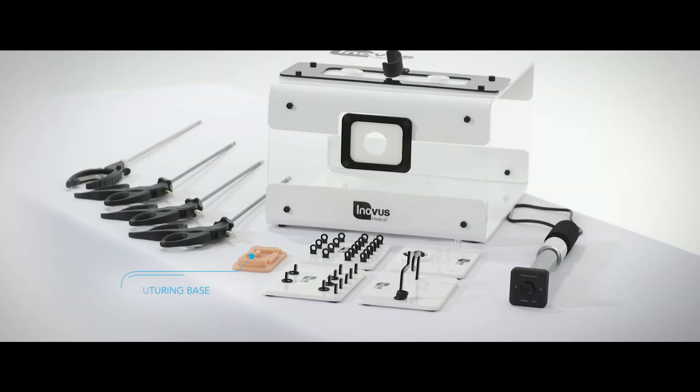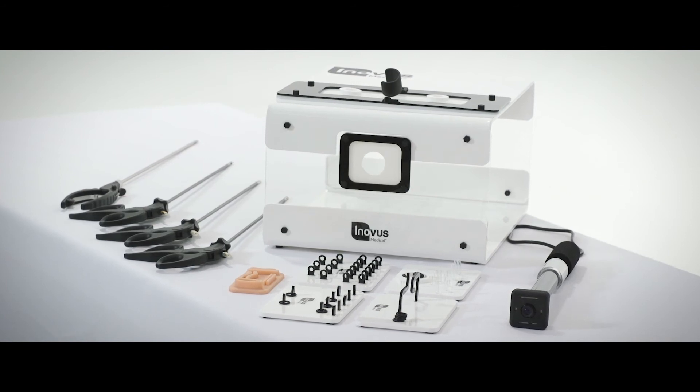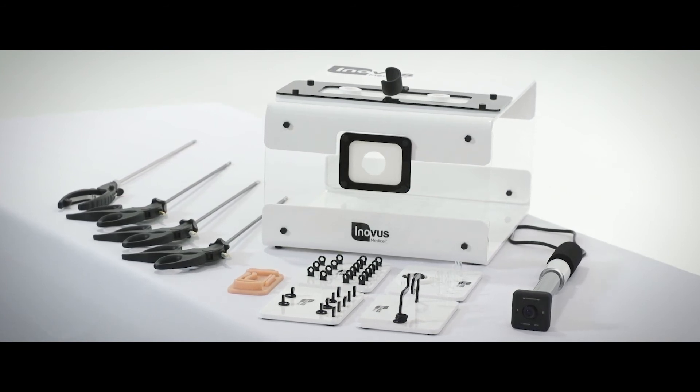The simulator also comes with a suturing base, which allows you to carry out both laparoscopic suturing and laparoscopic knot tying. The Pixis HDMove is perfectly set up to practice these more advanced skills.